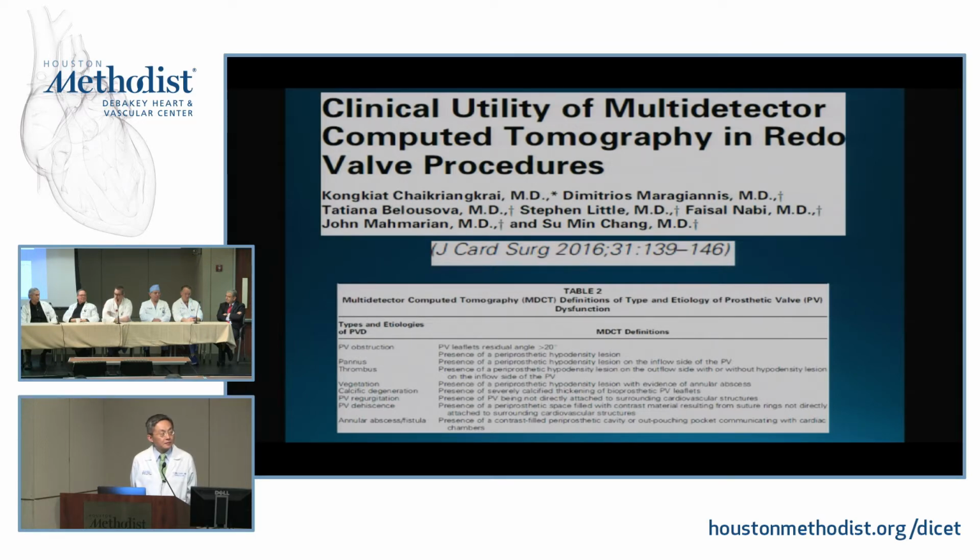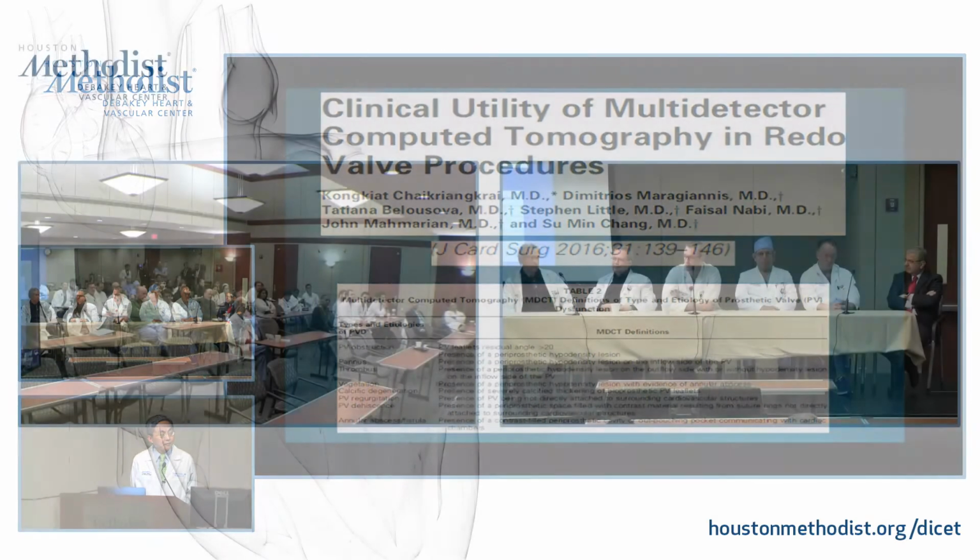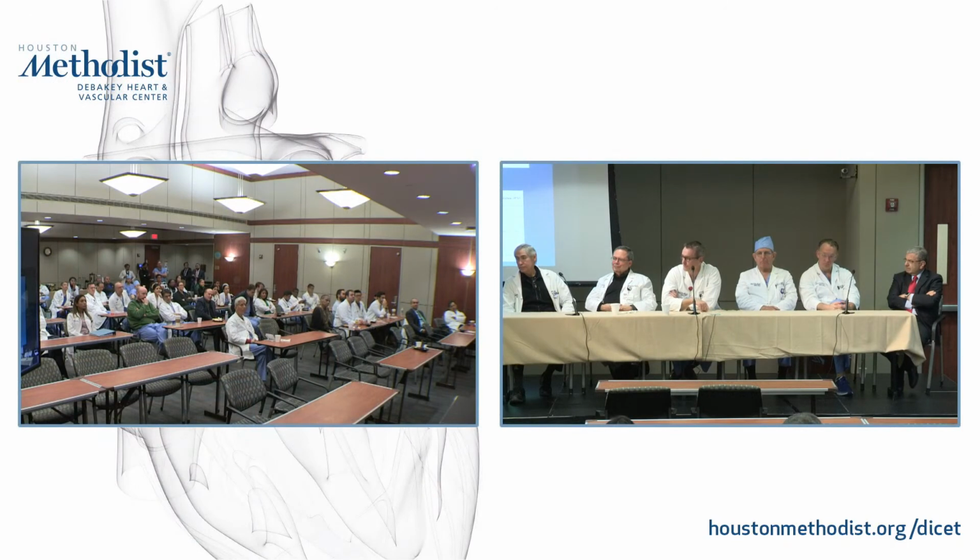But Parmraj, we've had great experience. We'll take the CT data set and go through it and tag it, and import that data into the fluoro suite, and project it on the fluoro screen, putting that X there, and all of a sudden things make sense. More often than not, it's an issue of interpretation and nomenclature, and do we really all talk about the same clock face, as opposed to the imaging modality actually missing the defect.